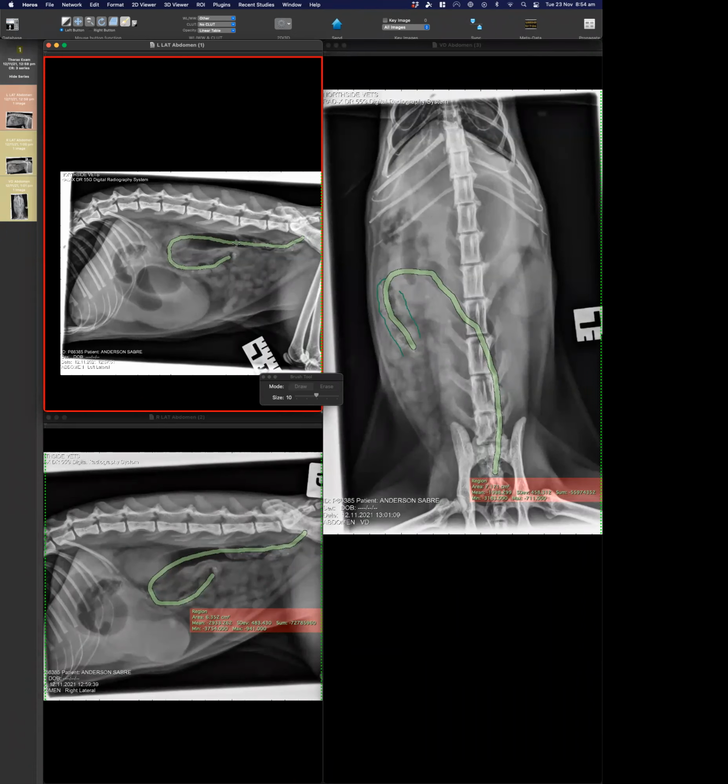Yeah, I agree. You have your routine in the clinic. So many problems, and that one is one. Positioning, being in a hurry with the positioning, dealing with the acquisition. Which kind of monitor do you have in that room? Most of the monitors there are just to check that the image is there and to check the positioning. You don't read the image there. It's just one image. You cannot put 2 images together.